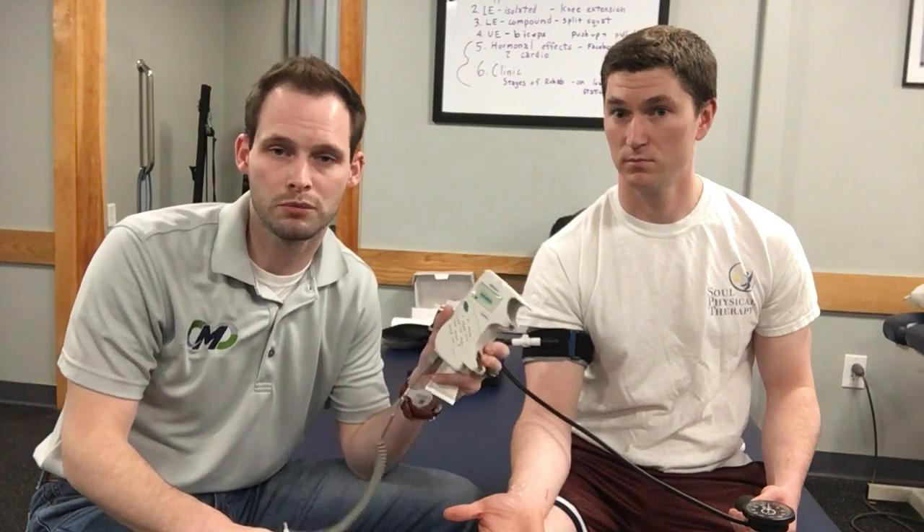First and foremost, I think it's important in the rehab setting to individualize the pressures more so than if you were just in a strength training scenario. One way that we can do that is to utilize a simple Doppler ultrasound.